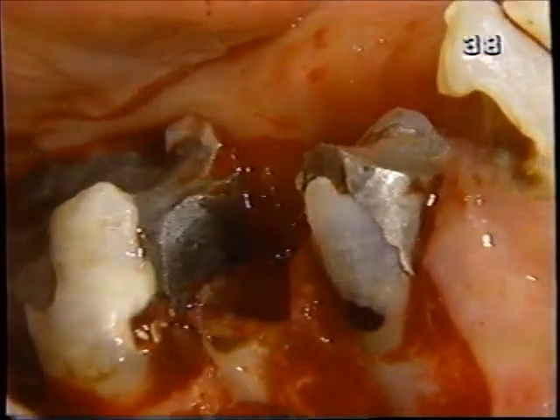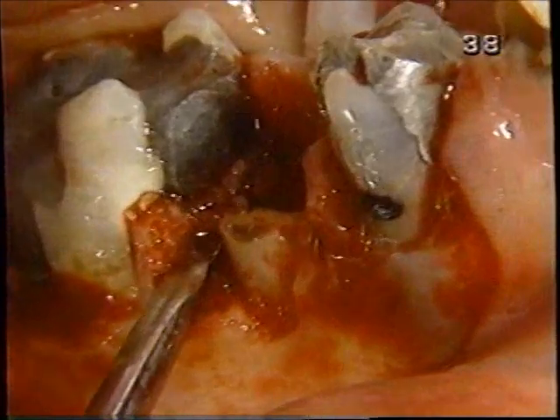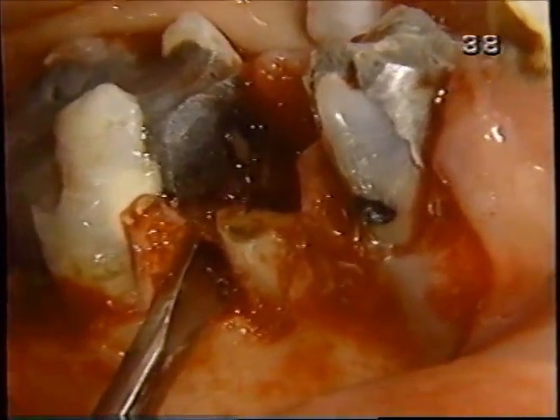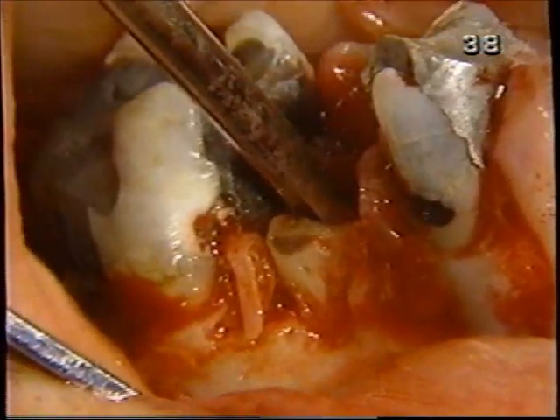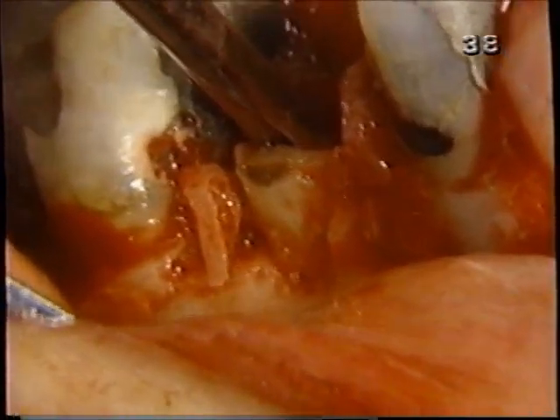Okay. We'll try to get a purchase on this on the side. Even though only part of the tooth broke, let's use this opportunity to do some further luxation here.